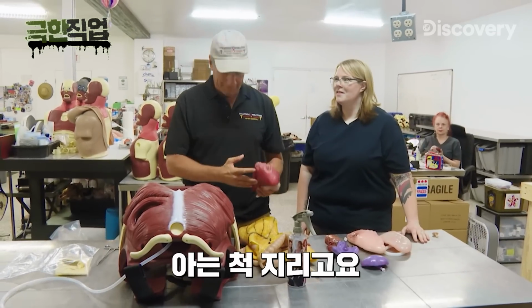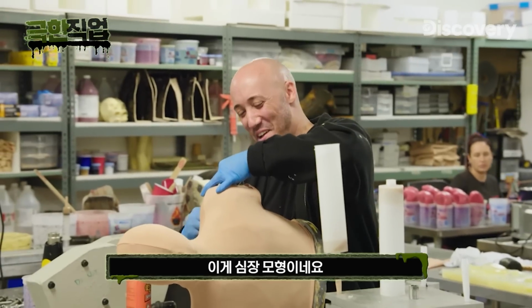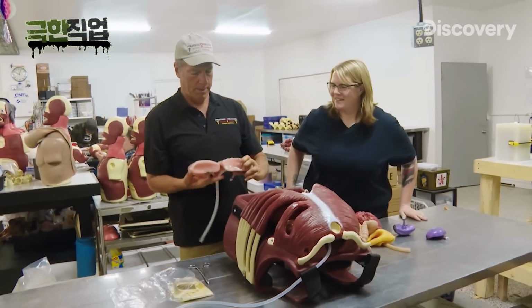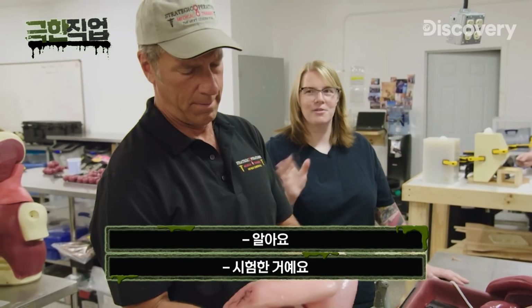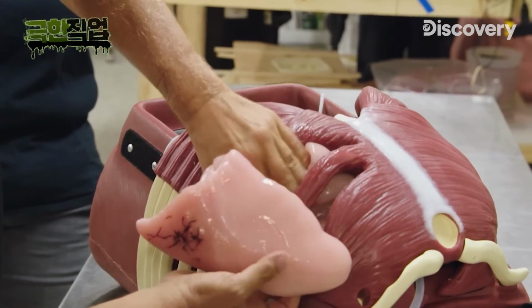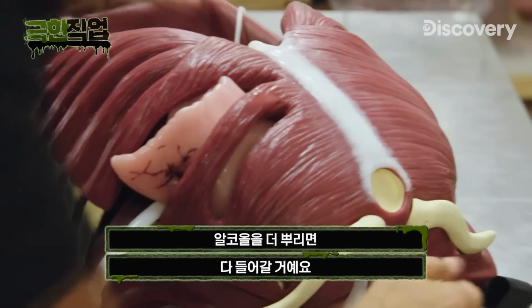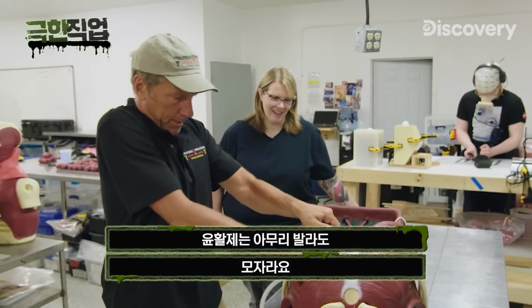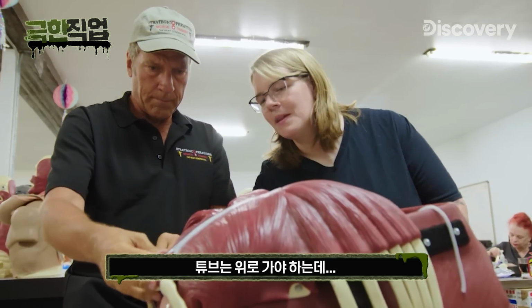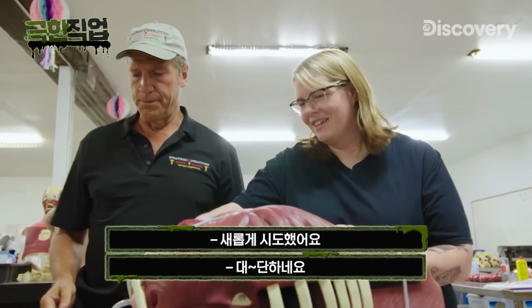Also, it's a liver. What are you laughing at, Michael? You just make your skins. Mind your business. Here's the heart. It's this heart-shaped thing. You're gonna want this. And they're upside down. Okay, you're testing me on that one. Shove them in there. If you spray more alcohol in there, it'll all slide in. I mean, nobody has ever said there's just too much lubrication. Now, this tube seems to be twisted up. Is this a problem? The tube should go through the top, which, oh, you got them flipped. How'd you do that? I've never seen that happen. I try and do new things.